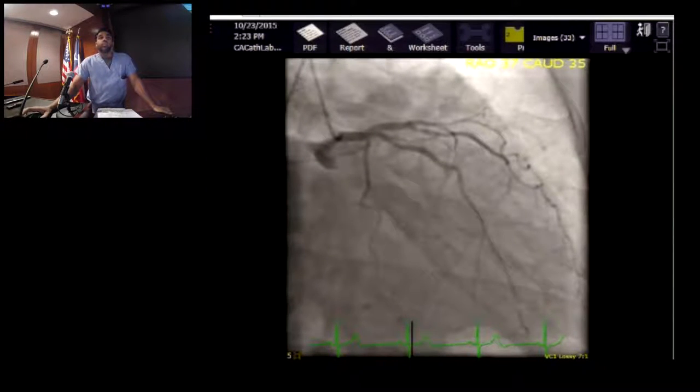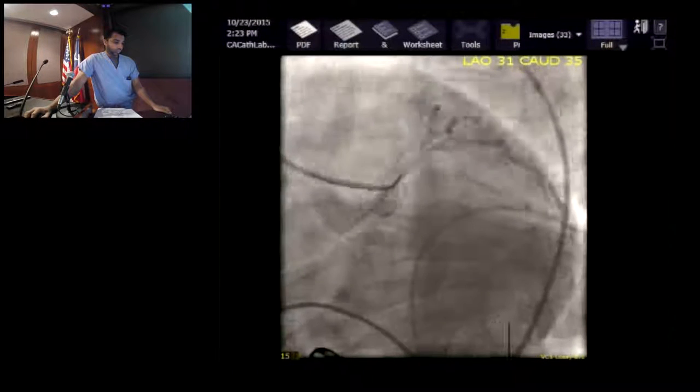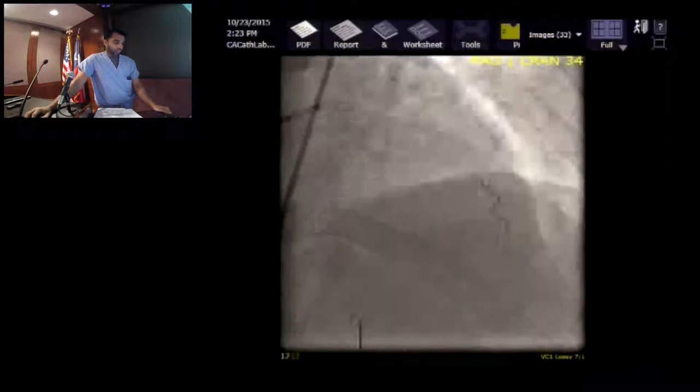The other thing is it's a pressure wire, not a catheter. The key point is that the aortic pressure is measured in the normal way, using the column of saline through the tip of the guide. Initially the distal pressure was measured with microcatheters distal to the stenosis, but the stenosis caused by the catheter would then falsify the FFR.